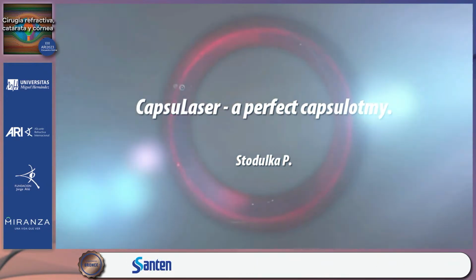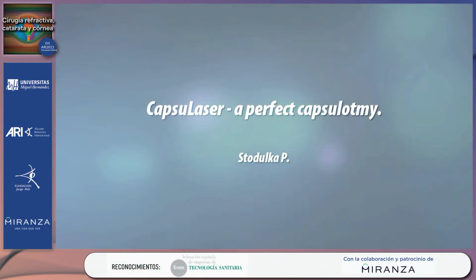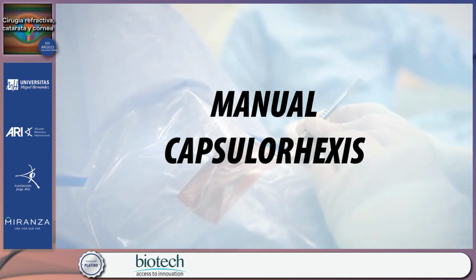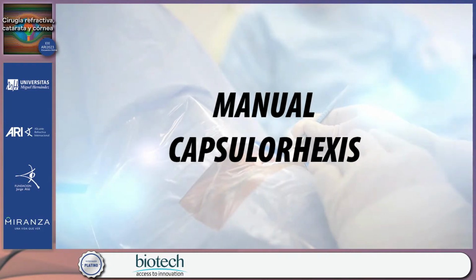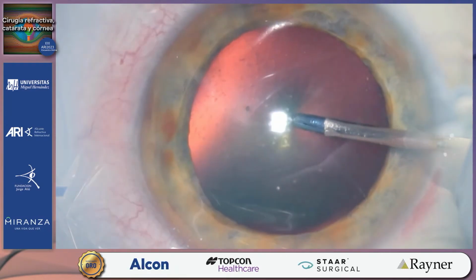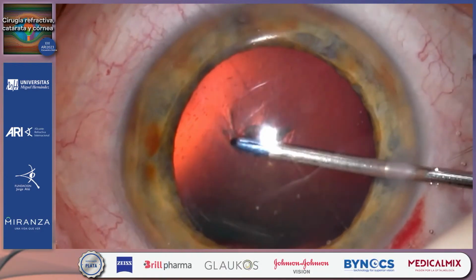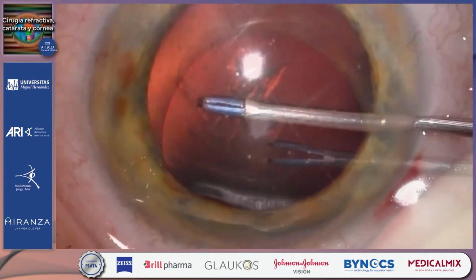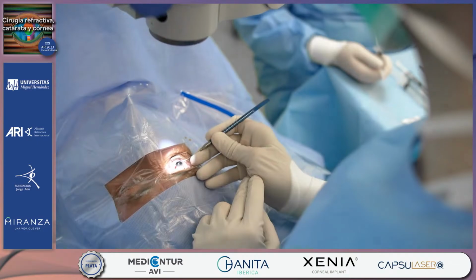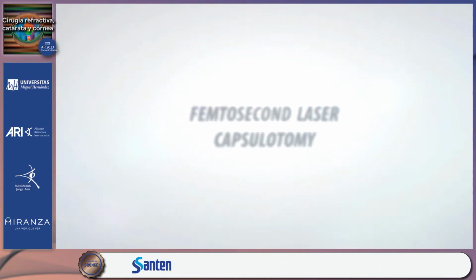A circular opening in the lens capsule is a gate inside the lens for cataract surgery. The most common way to open the capsule is a manual capsulorhexis. Handheld forceps are introduced through the main or side port incision to punch the capsule and create a circular opening in it. Capsulotomy can be performed by laser with the promise of high precision.